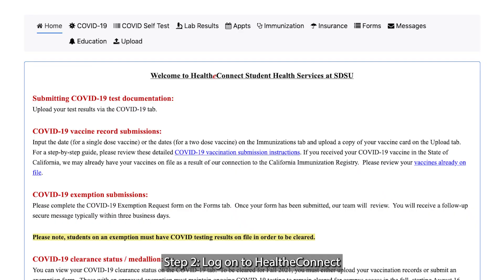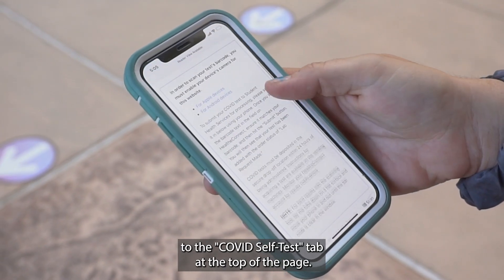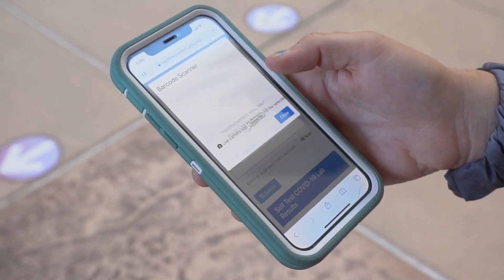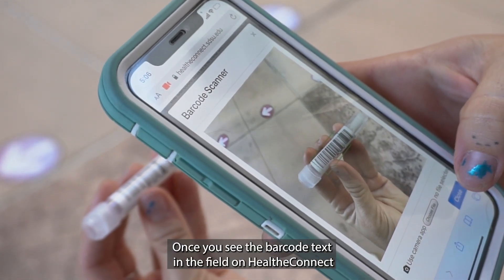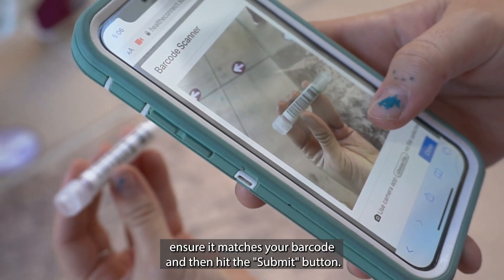Step 2: Log on to Healthy Connect. Using your SDSU ID, log into your account and navigate to the COVID self-test tab at the top of the page. Step 3: Scan your test. Scan the barcode on your test tube using your phone. Once you see the barcode text in the field on Healthy Connect, ensure it matches your barcode and then hit the submit button.